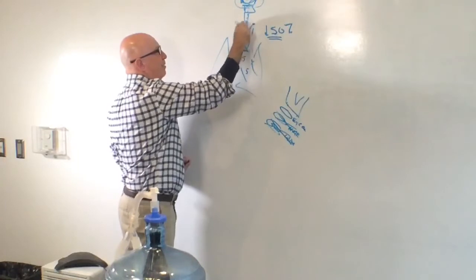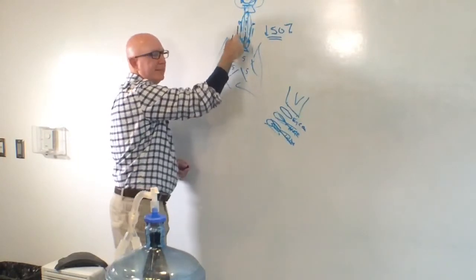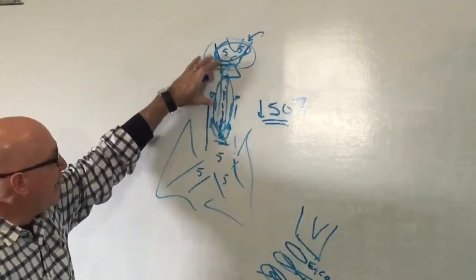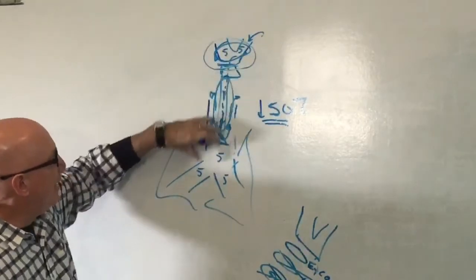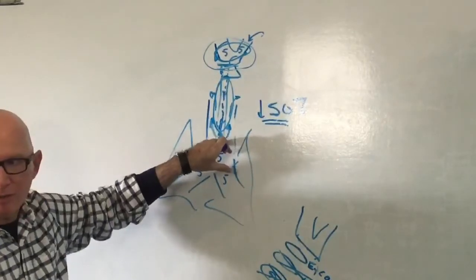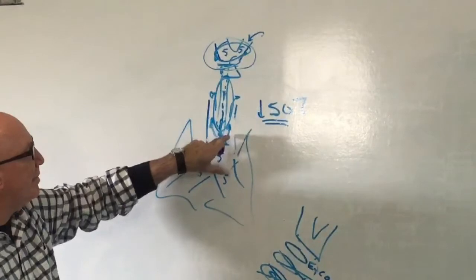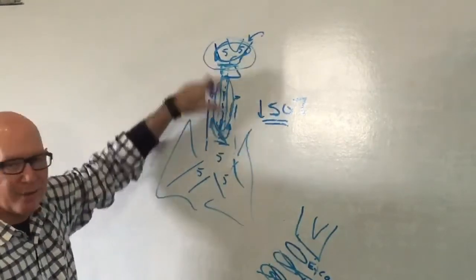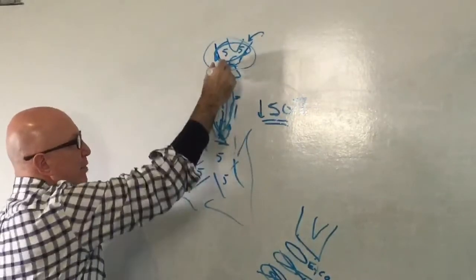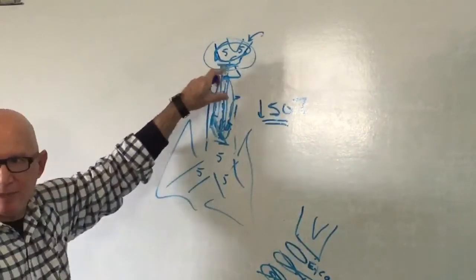So this flow going down your endotracheal tube during the expiratory phase comes out the distal end, leaks out past the mouth, and what does it do to the alveolar gas that's inside the endotracheal tube? It actually washes it out. So in effect, that constant flow of gas going through with a leak that's continuous during the expiratory phase, I can't say that enough, that's the important piece in this. If there's a leak continuous during the expiratory phase, then this is no longer dead space anymore, because, technically it is, but you're flushing out that dead space gas during the expiratory phase because of the leak.